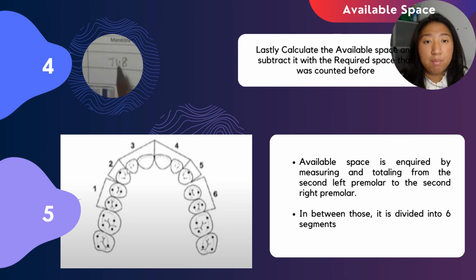Available space is acquired by measuring and totaling from the second left premolar to the second right premolar. As you can see in the figure, there is a segment for the first and second premolar on the right side. Like I mentioned previously, the first segment, then the canine as the second segment, and then the central and lateral incisors. On the left side is the third segment, and then the fourth, fifth, and sixth. It is quite the same as the first, second, and third segments, but the difference is that its location is on the other side of the arch.